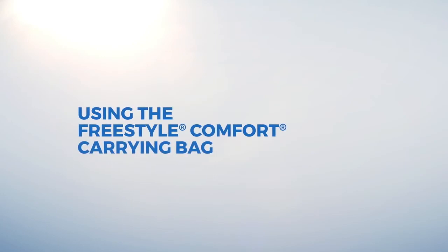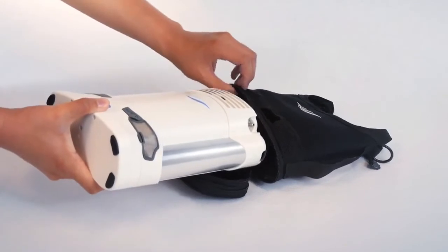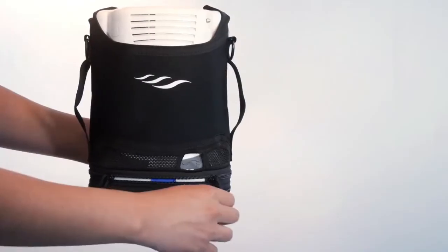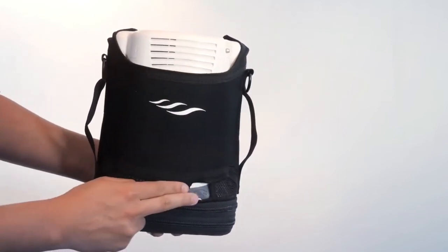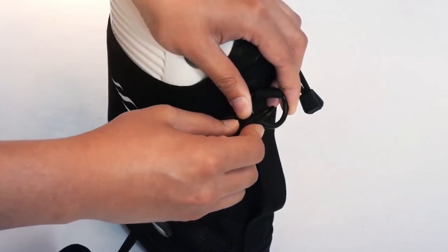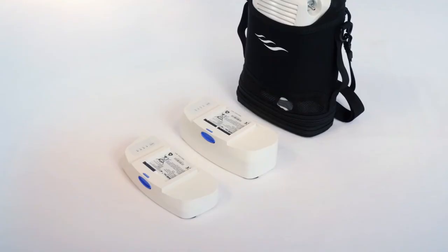To insert the Freestyle Comfort into its carrying bag, place the bag face up on a flat surface and insert the Freestyle Comfort into the bottom of the bag. After zipping up the bag, make sure the air intake filters, the oxygen outlet, and the charging receptacle tab are not obstructed. Attach the shoulder straps to the bag utilizing the loops on either side, and you are ready to go. Remember, the carrying bag can accommodate both size battery packs.